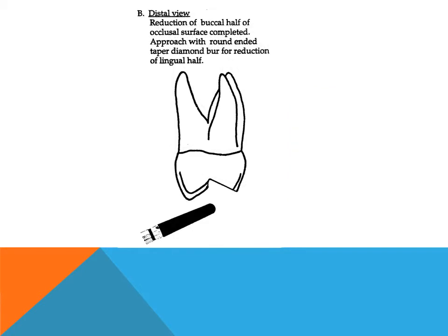Using a palatal approach of the handpiece, the same burr is used for the reduction of the lingual half of the occlusal surface. The stone is held parallel to the inclined planes of the lingual cusps and 1.5 mm of tooth structure is removed.